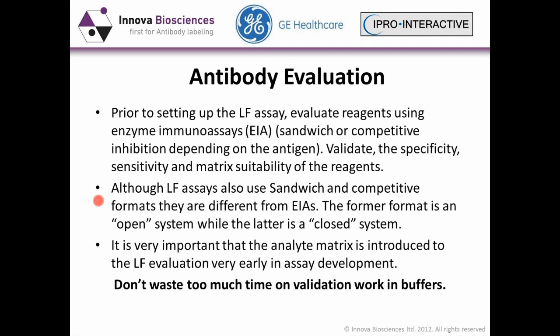Once the antibodies are obtained, the next step is to evaluate the assay. I would strongly recommend that people don't move straight into developing a lateral flow assay, but first evaluate the antibodies on the actual assay using a laboratory-based system, because you could also have enzyme immunoassays based on the sandwich or the competitive inhibition format, so that kind of mimics what you get in the lateral flow assay as well.